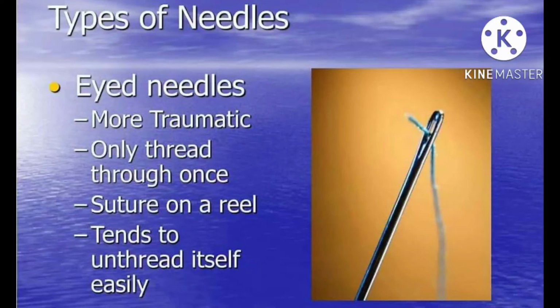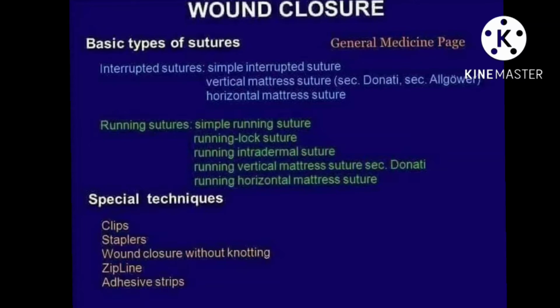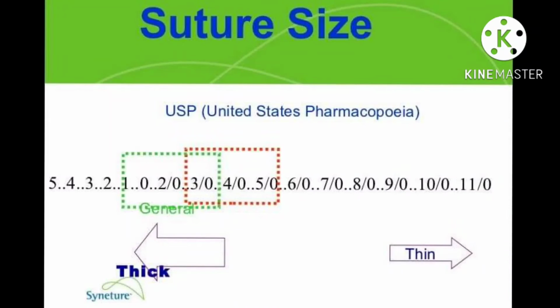Their downside is a greater inflammatory reaction and an increased potential for bacterial seeding, as the weave of a polyfilament suture can be thought of as a nest for bacteria.